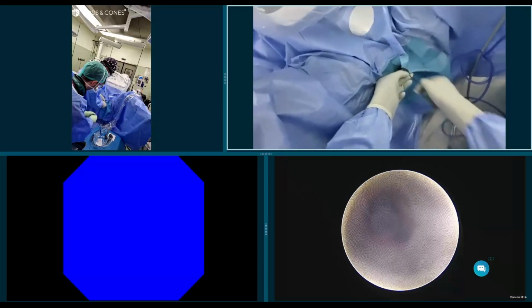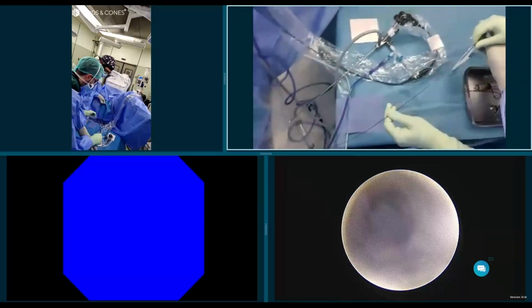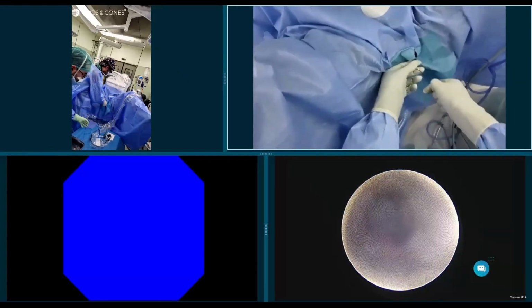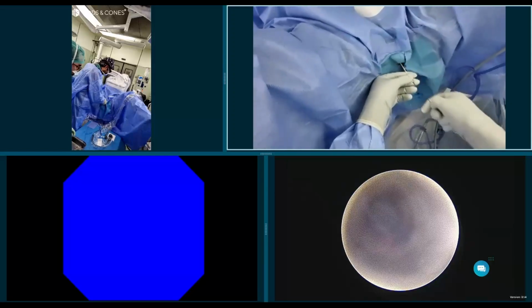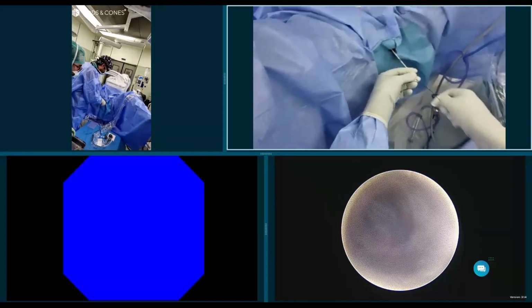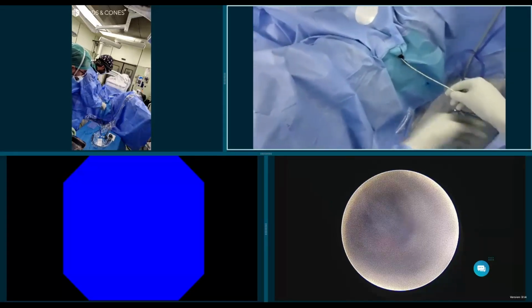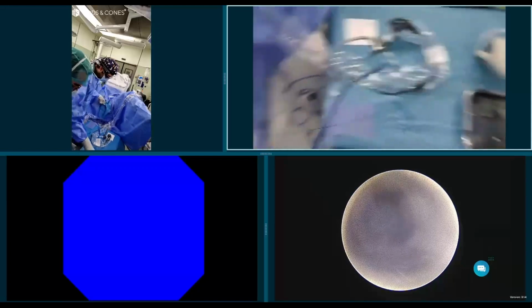So I always like to start with a hydrophilic guide wire. And to avoid any radiation exposure, what I do is that I feel what I'm doing. Once I feel the proximal coil, I just retrieve my stent. I'm reducing radiation exposure like this. I grab it with my fingernails and I remove it.